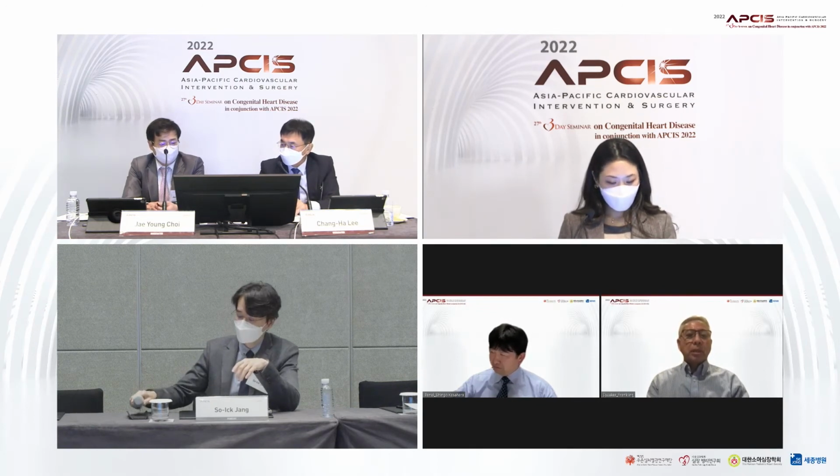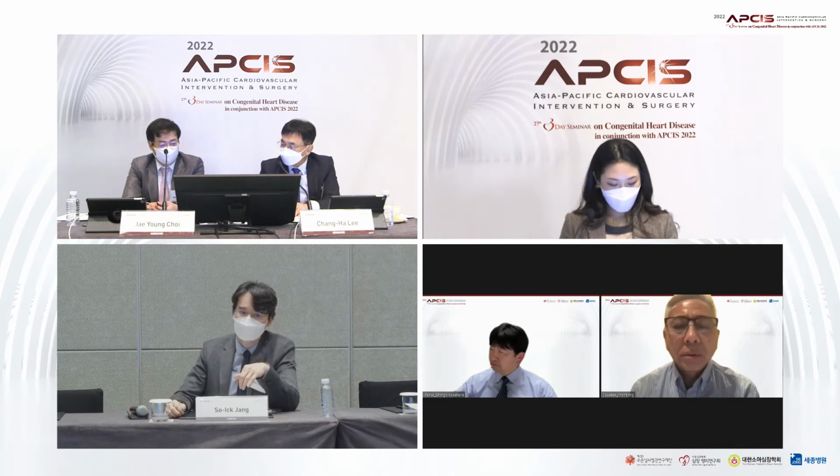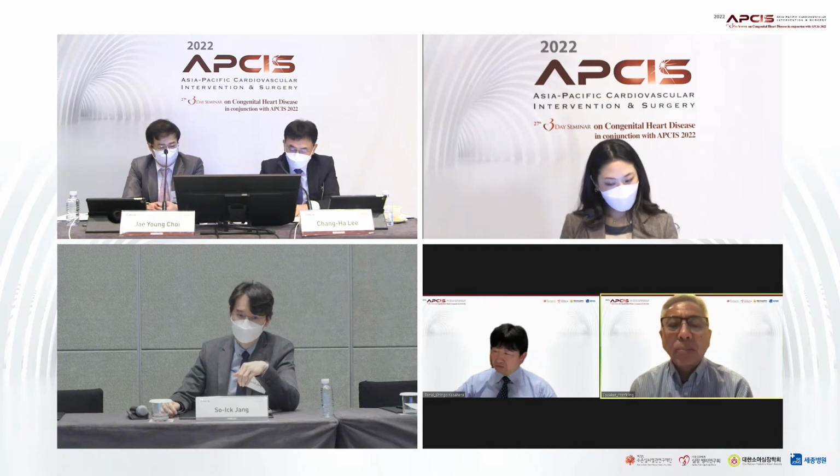In this kind of lesions, would balloon angioplasty work without a stent? No, I don't think so. But in general, my principle when I see these very diffuse stenosis is that I try to put a stent in the proximal vessel first. I've found that sometimes when you put a bigger size proximally, you get more flow, and then the distal part actually gets bigger on its own.